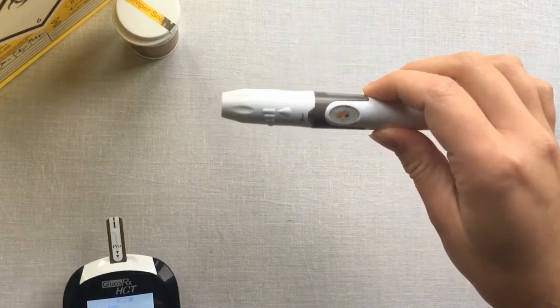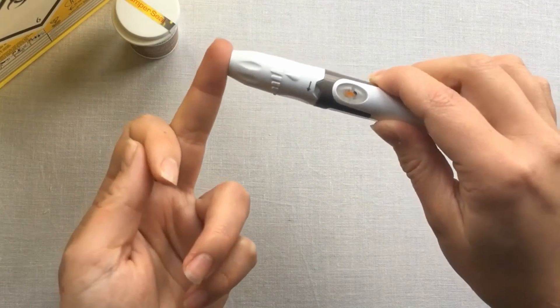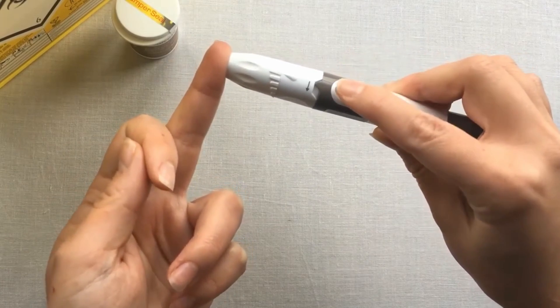Take your preset lancing device and hold it firmly against the puncture site. Apply pressure to the orange trigger button.